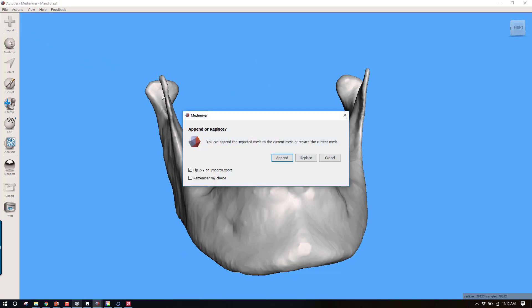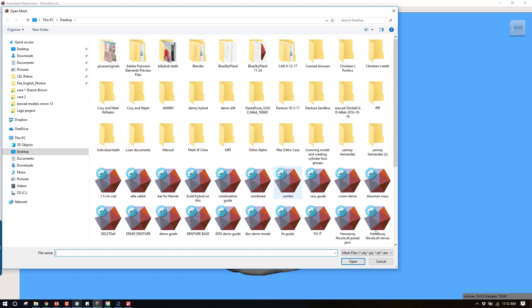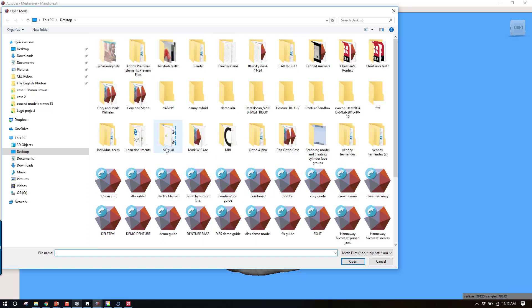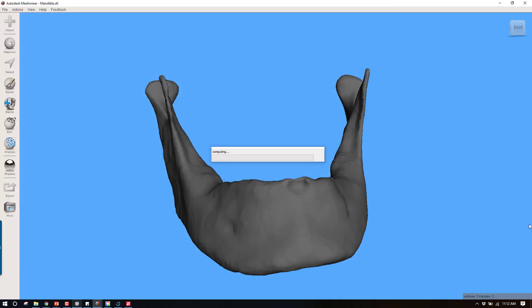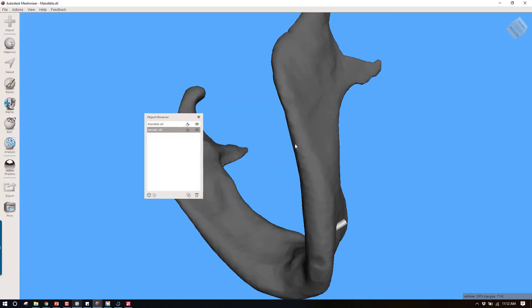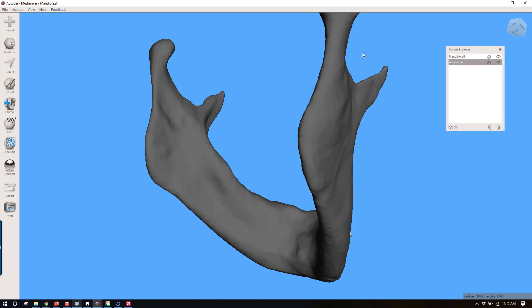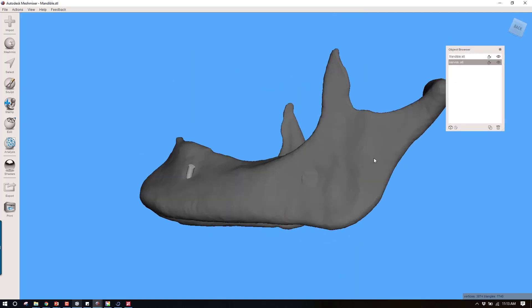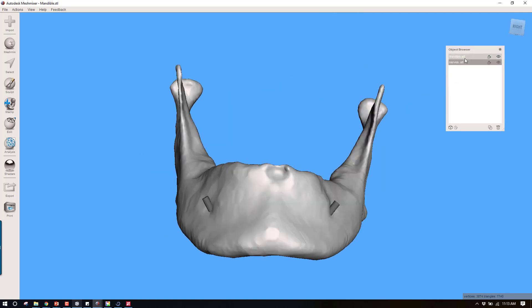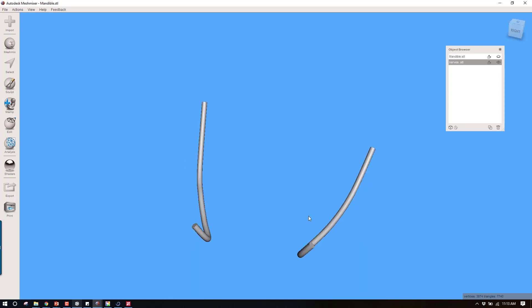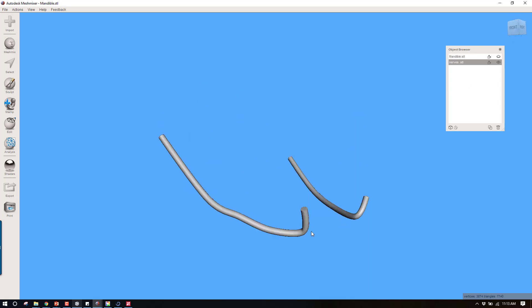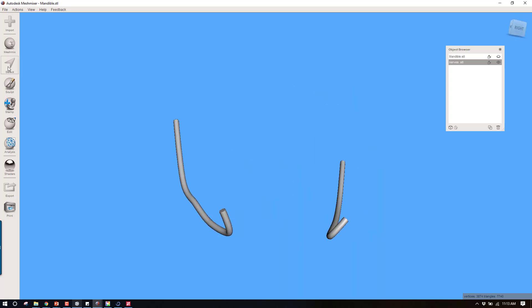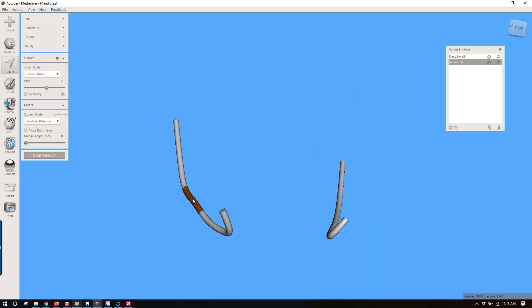I'm going to import and append. What I want to append is the nerves. So let's find that file. Nerves. You can see it pulls this right in. Now we have both nerves. Now one thing I will tell you, if you look currently, these nerves are joined together as a single STL. Even though they're two distinct objects, they're functioning together.